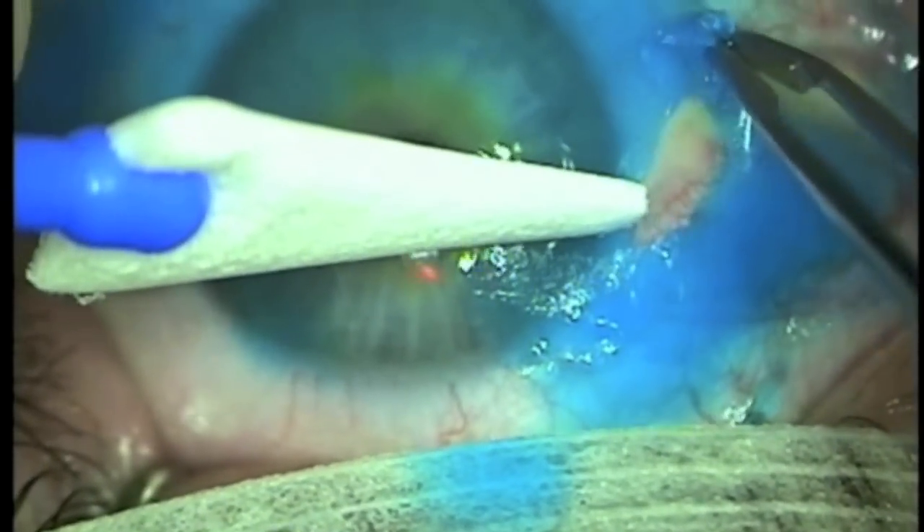As it is being applied, it starts hardening and drying. Before long, the tissue glue is covering the whole eye. The excess tissue glue can then be removed either by tearing it, much like one does a capsulorrhexis, or with the use of micro scissors.